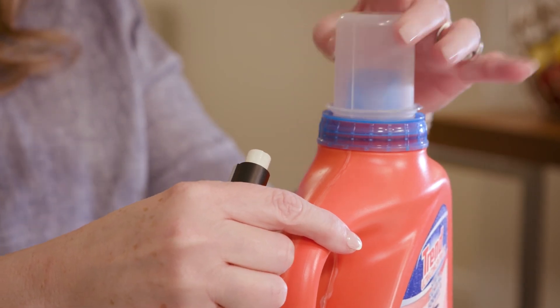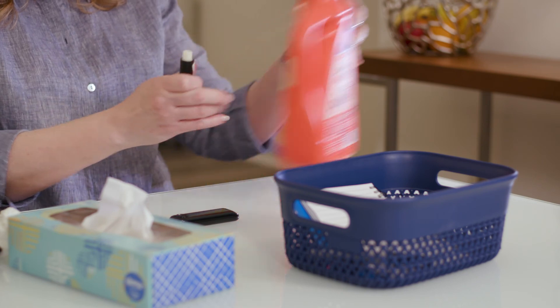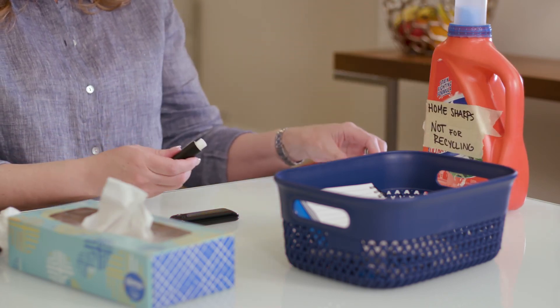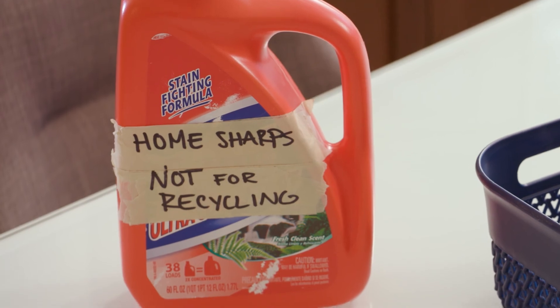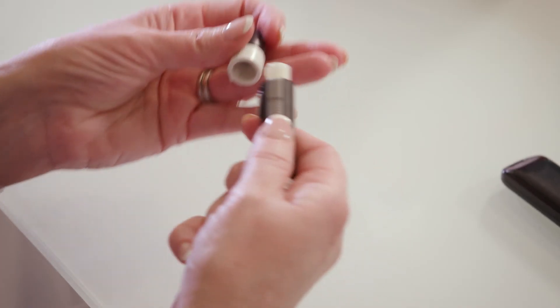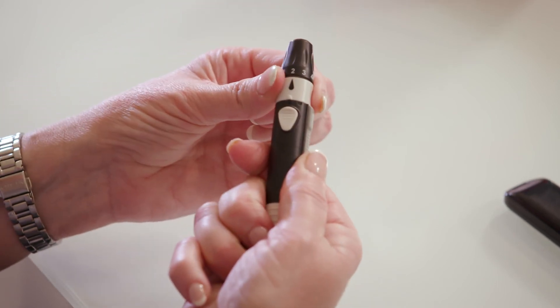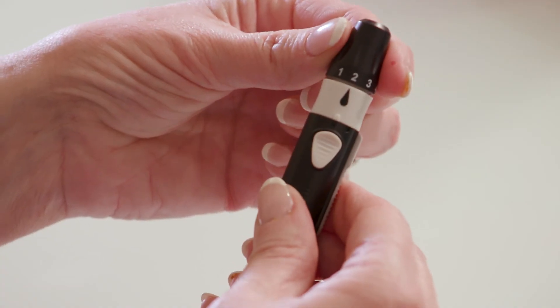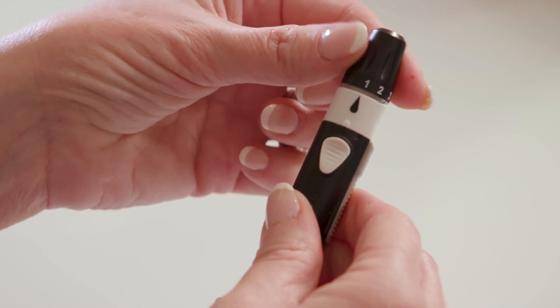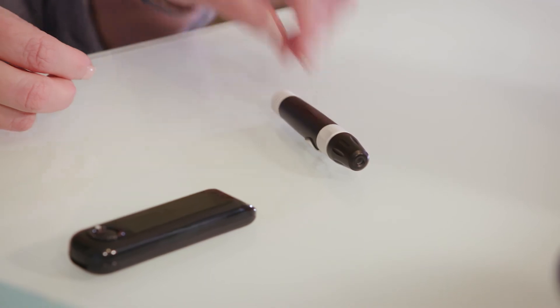Don't pull the lancet out with your fingers. The plastic tab can easily come off and you can poke yourself with the needle. Once the lancet falls into the sharps container, slide the lancet ejector back into place. Put the end cap back on and lock it. If you got more blood than you needed, turn the dial to decrease the puncture depth by one level so the lancet won't prick as hard next time.